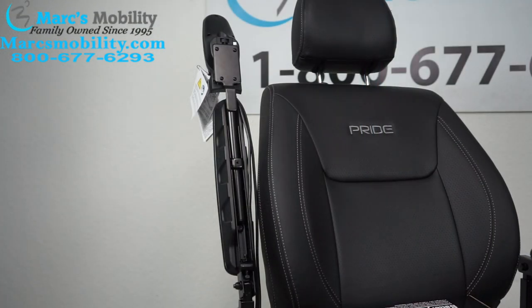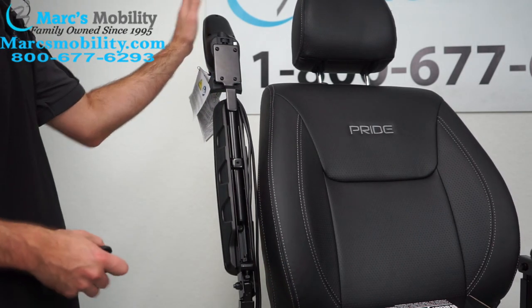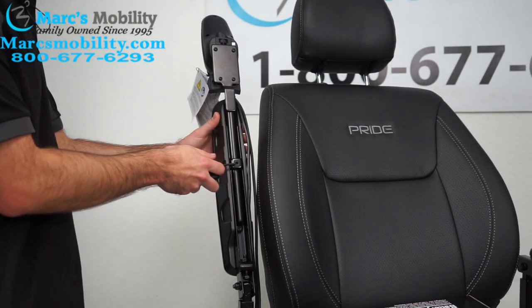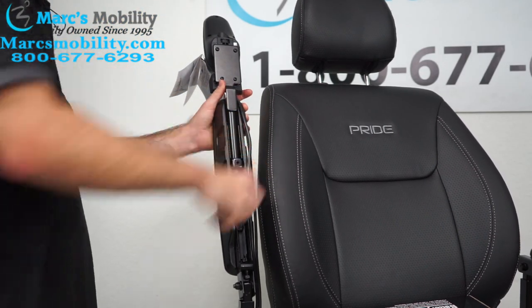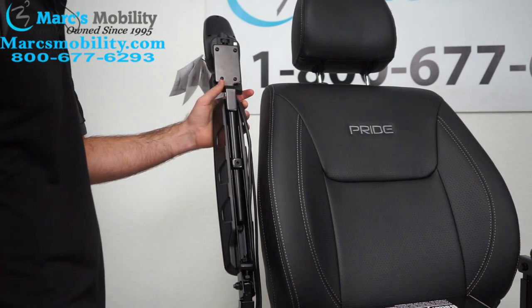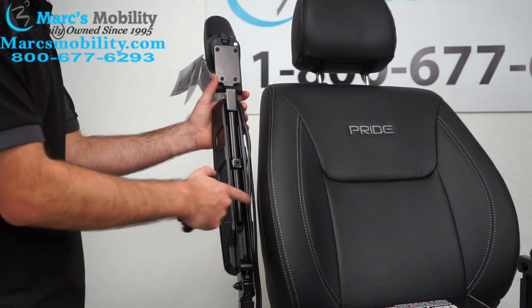The last adjustment we can make to the Jazzy Air 2 is to the joystick. We can bring this joystick forward if you want it to sit a little further forward. You would do this by loosening this Allen screw right here. The Allen screws should be provided with your chair if you get a new one. You might have to cut some zip ties if whoever you bought the chair from zip tied this wire to the arm.